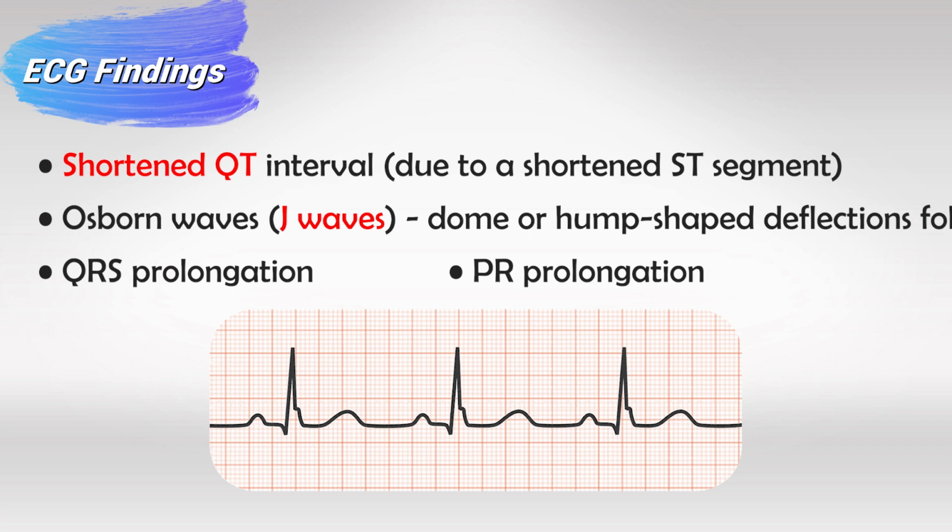I like to think of it as someone's trying to stretch the ECG and everything is stretched. So there will be prolongation all over. But the QT interval, which is one of the largest voltages, will be constricted trying to overcome this stretching. So you will have prolongation all over except in the QT interval, which will be shortened.